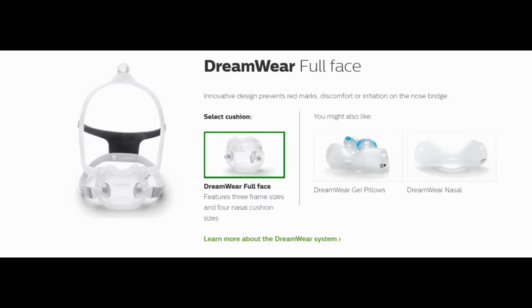Is there a benefit for the DME regarding the frame? And from a stocking standpoint, is there any benefit there as far as cutting down on the number of things they need to stock when they are interchanging those different end pieces, if you will, the actual interface part? You know, there are fewer pieces, so yes, that's a benefit.